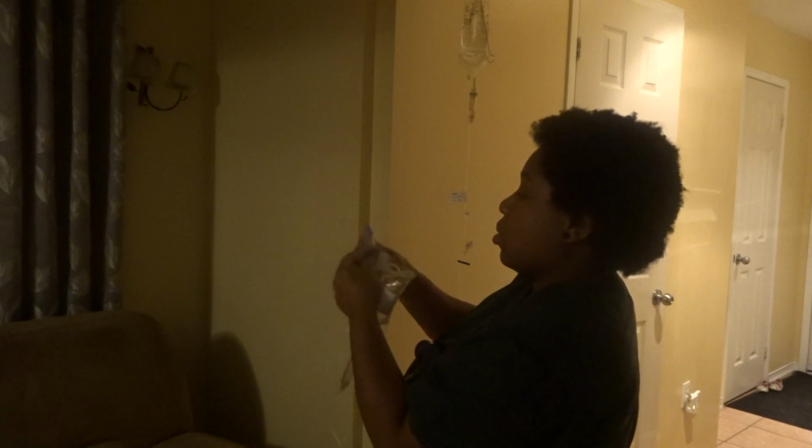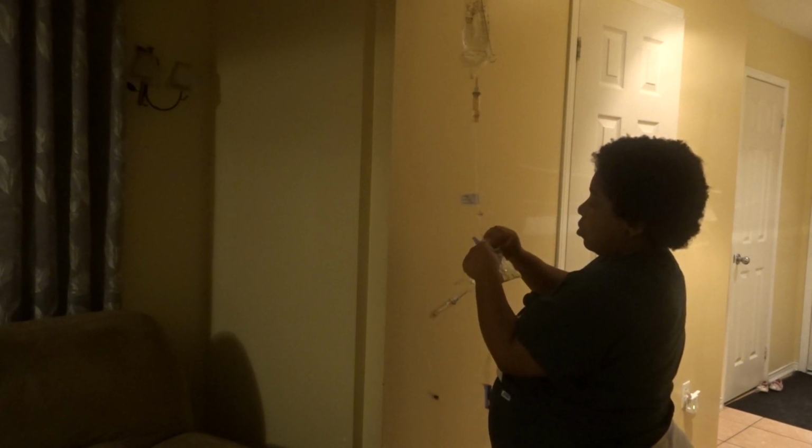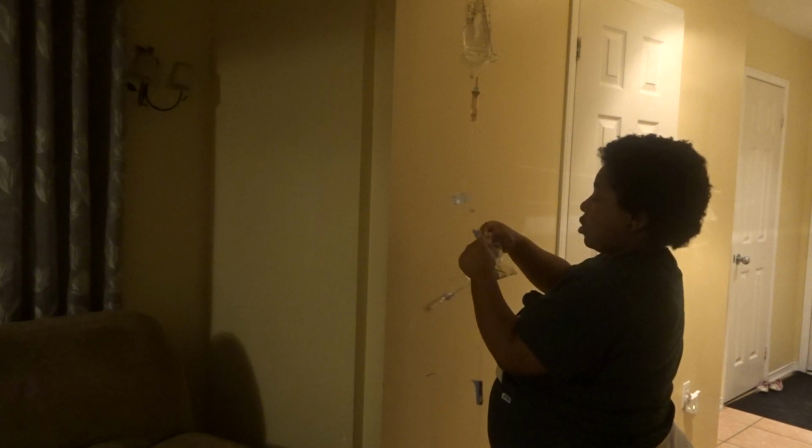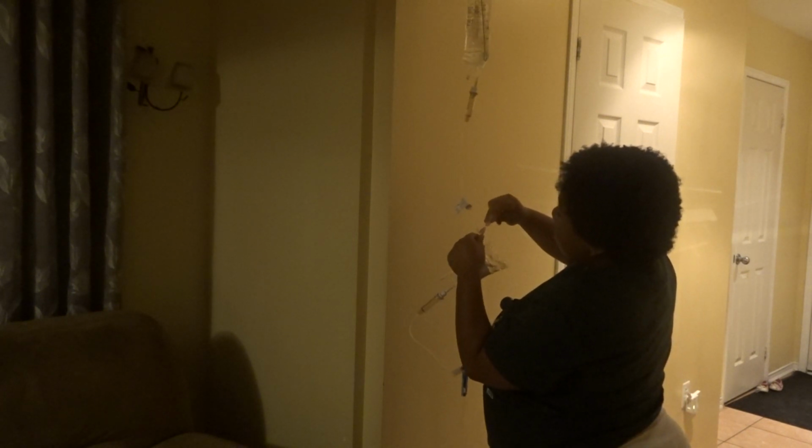So after locking it, I'm gonna take my alcohol wipe, cleaned it, attach safely.